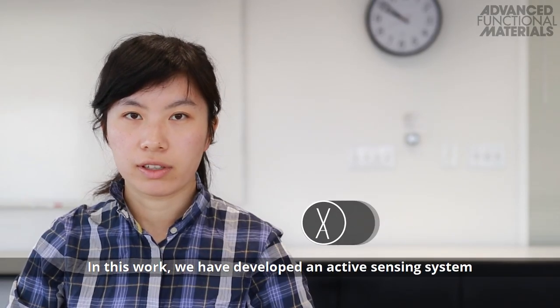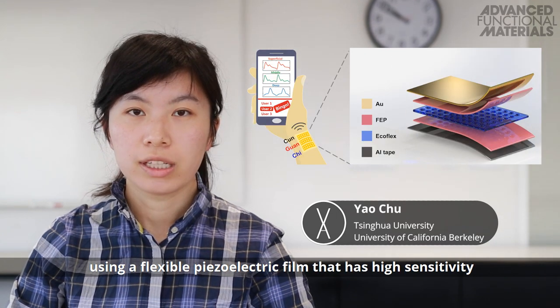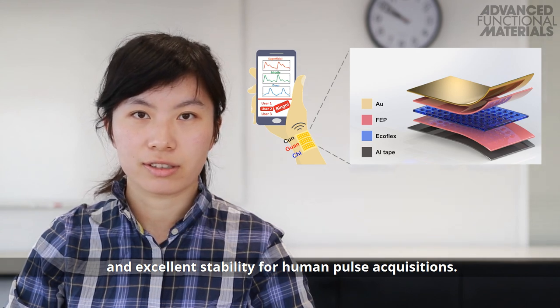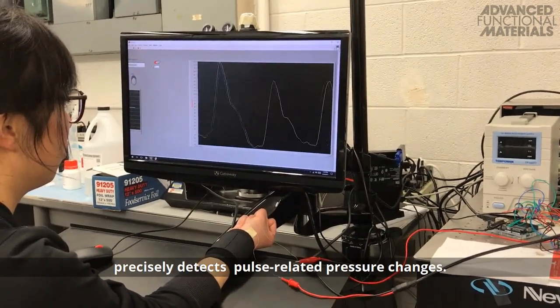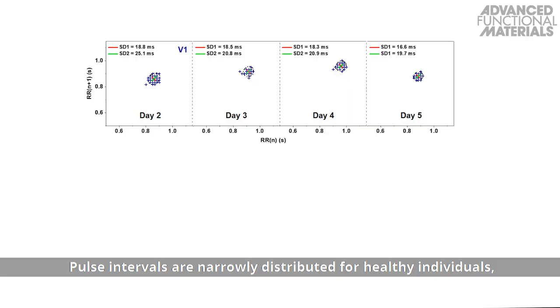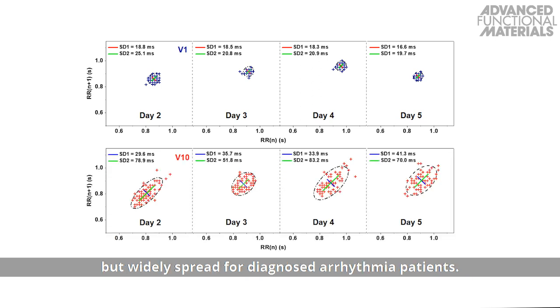In this work, we have developed an active sensing system using a flexible piezoelectric film. It has high sensitivity and excellent stability for human pulse acquisitions. A wrist-based sensor precisely detects pulse-related pressure changes. Pulse intervals are narrowly distributed for healthy individuals but widely spread for diagnosed arrhythmia patients.